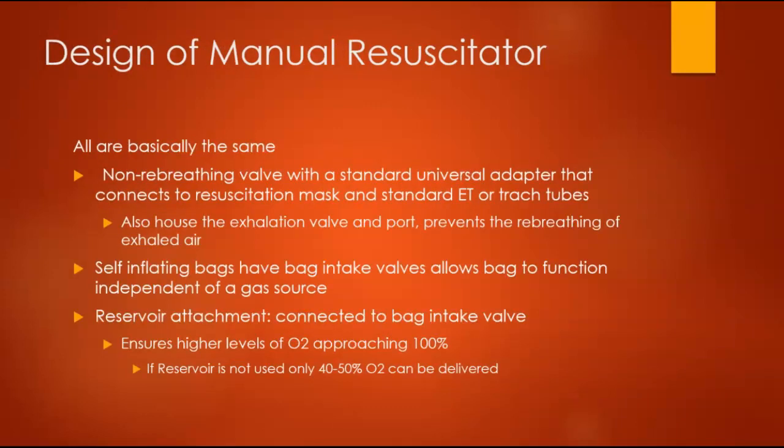So design of the manual resuscitator, all are basically about the same. There's typically a non-rebreathing valve with a standard universal adapter that connects to the mask or an ET tube, trach tube. All of these standard adapters are the same. They're a 15 millimeter adapter. It's called a universal adapter. All respiratory equipment has to have one so that all stuff will fit. So we're not running into a situation where we're standing at the head of the bed not knowing what to do because our mask doesn't fit with our bag.